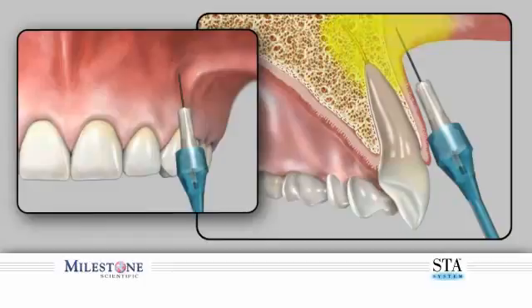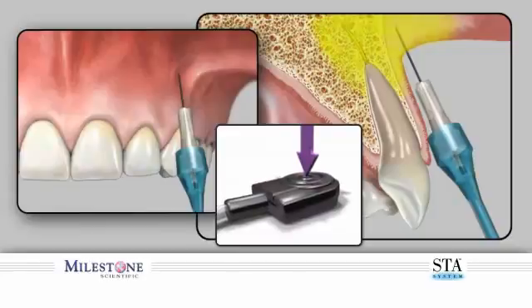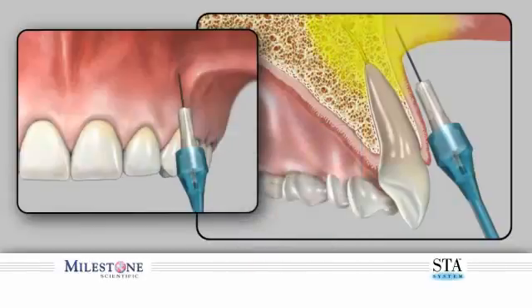To enter into the rapid flow rate, depress the foot control pedal beyond the halfway down position. This will allow you to enter into the second, more rapid flow rate in which you can administer the remaining amount of anesthetic solution. This should only be used after your patient indicates that effective soft tissue anesthesia has occurred. When you have delivered the required dosage, you can remove the needle.